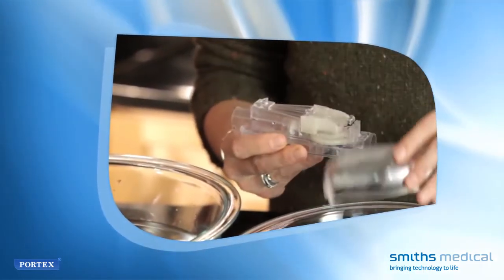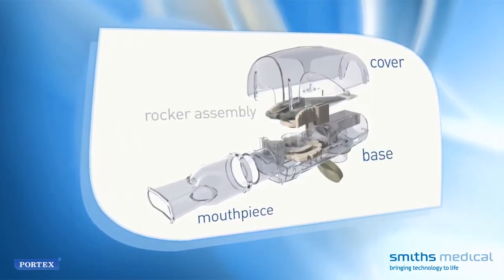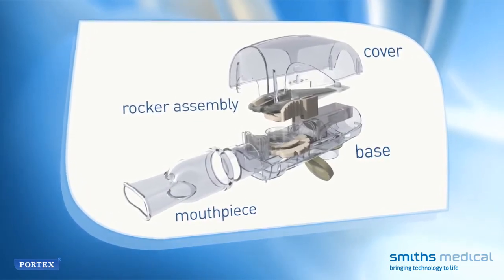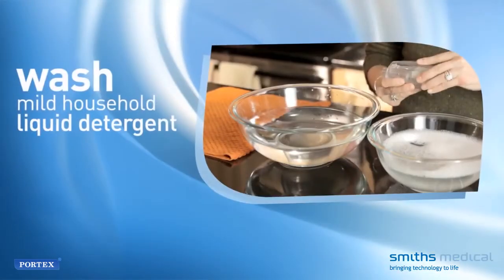Disassemble the unit. There are four parts that need to be cleaned: the cover, the mouthpiece, the base, and the rocker assembly. Do not attempt to disassemble the rocker arm from its platform base. Separating these components may cause the device to function improperly.